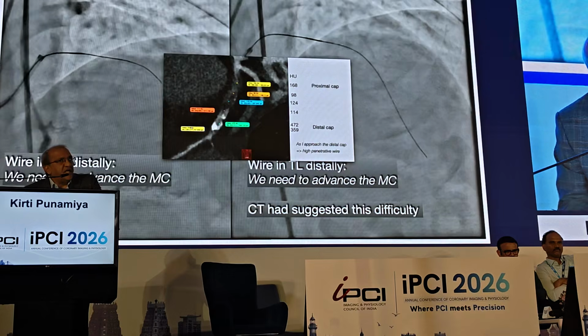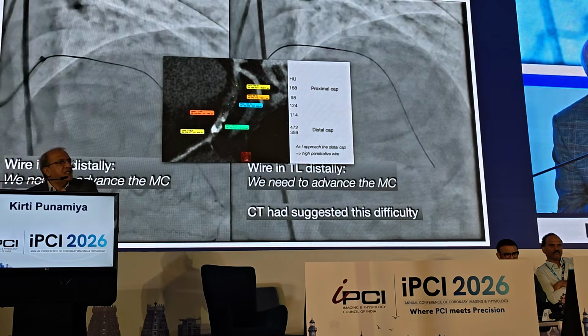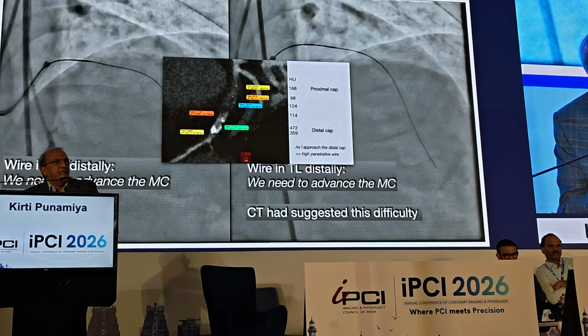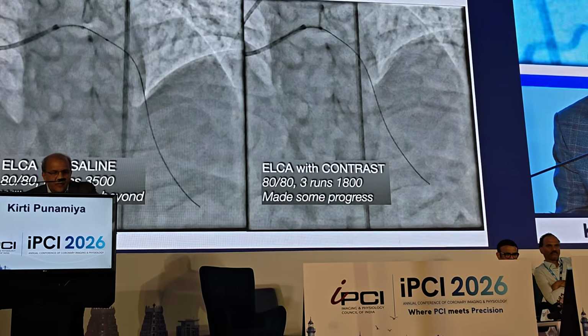Our experience and my experience tells me that in this level of calcium, if I can truly modify this lesion, not just achieve crossability, but if I can modify the plaque with a single device, like an excimer laser, then I don't need other tools to do much to the calcium. And that is exactly what we did.